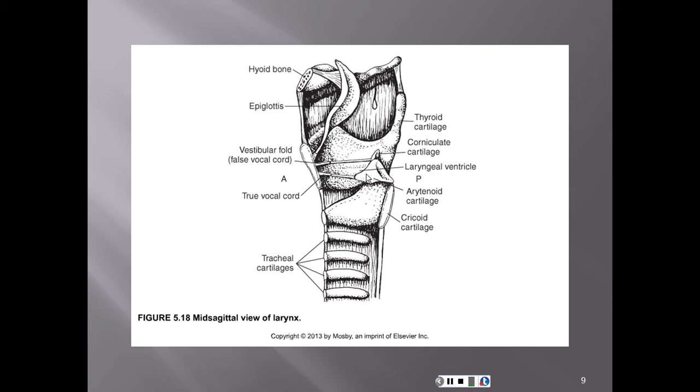These are markers that you can readily identify on the neck, whether you're doing MRI or CT, and pretty much examinations of the neck will be using the CT as the modality of choice. But sectional anatomy is going to cover the neck, so therefore we will have to cover the neck extensively.